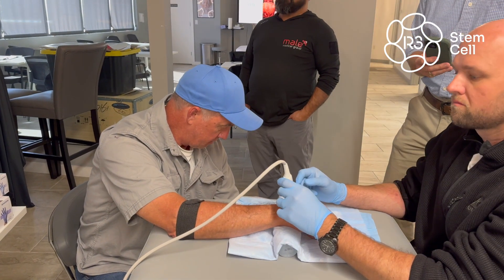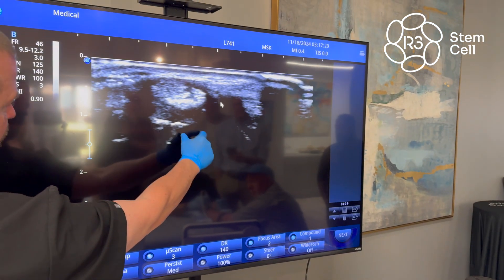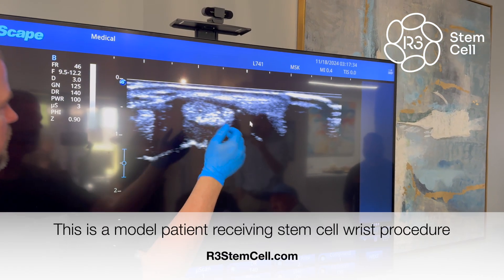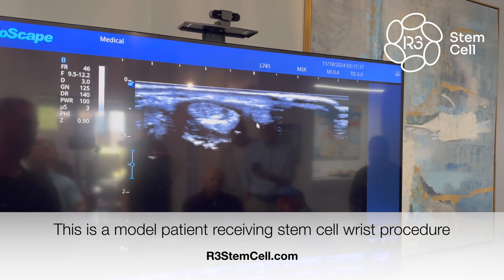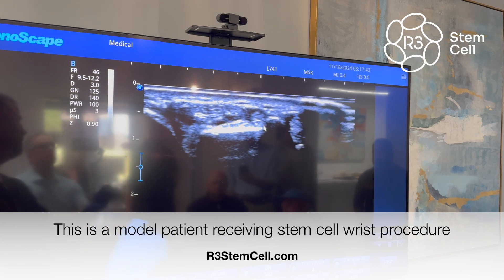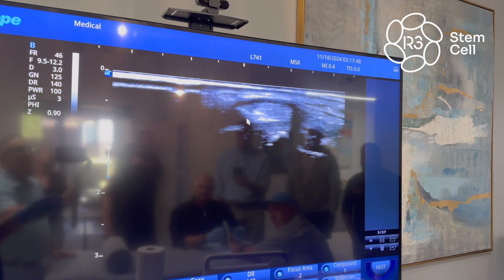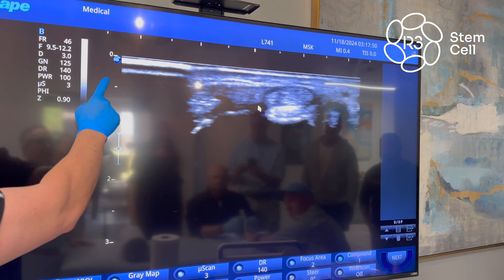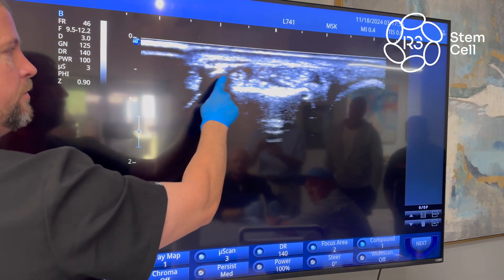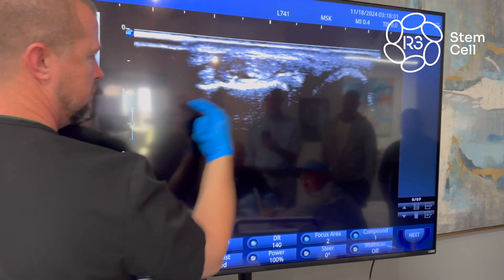You're a little bit distal — I'm seeing lunate, so we just passed by scapholunate. This is compartment number four: extensor indices proper, extensor digitorum communis. Now this is ulna, this is radius. That was lister's tubercle — not incorrect, nothing wrong with it. That was the lateral side, this was the medial side. Now flipped: lister's tubercle, compartments two, three, four, five, ulna, distal radial ulnar joint.